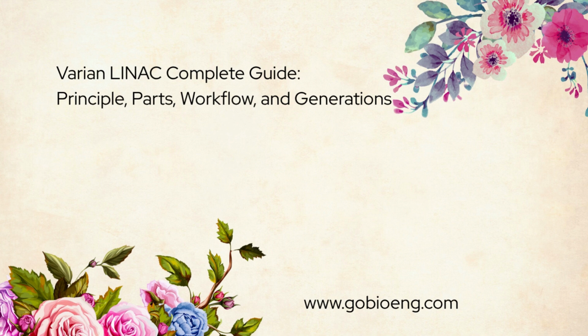And that matters, because the engineering role is not just about fixing faults. It stretches across preventive maintenance, calibration support, fault diagnosis, component replacement, hardware checks, software checks, documentation, managing uptime, and knowing when to escalate if patient safety or treatment accuracy is at risk. A strong radiotherapy engineer needs technical skill, yes, but also judgment. They need to recognize when a fault is minor, when it disrupts clinical workflow, and when it could compromise treatment safety.